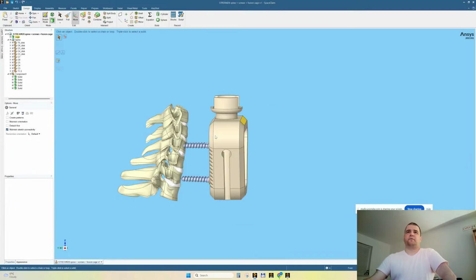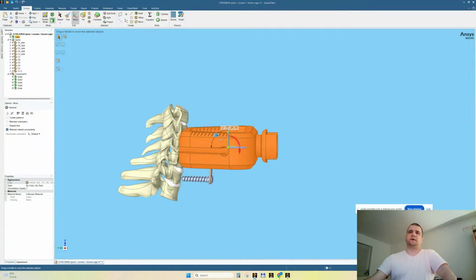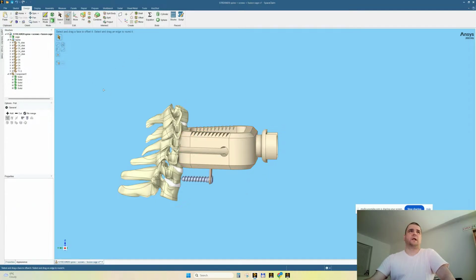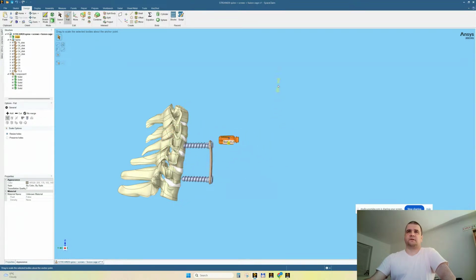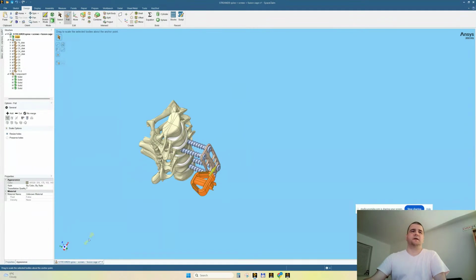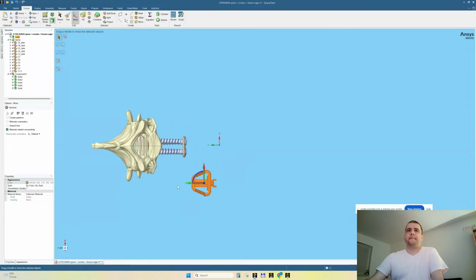All right, so of course this is kind of too much. Let's triple click and rotate it with 90 degrees, and let's scale it. Scale body, this body, how much? I forgot to click the anchor point. Then the body. Let's do it kind of visually, something like this. 0.25, for example. Let's see if it's enough. Move. And inside. I think it's kind of too much.